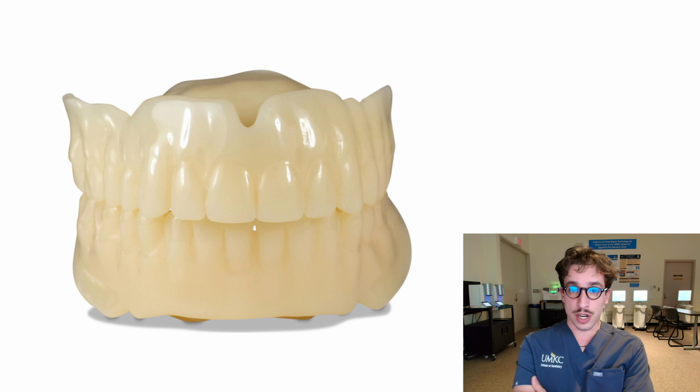So you'll take a bite registration. Again, for anything you're giving back to us to scan, we need to have the occlusal registration there as well. And then you're also going to be writing a lab script with exactly those changes that you would like to make. And then we'll get back a new setup, which we'll then 3D print again and try in. And then we'll make changes off of that as needed.